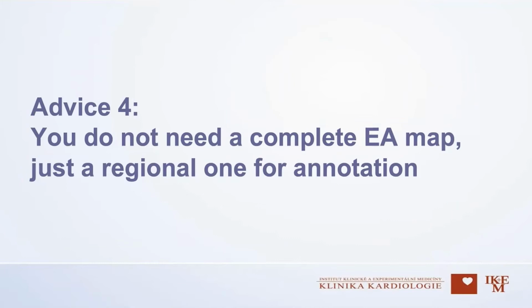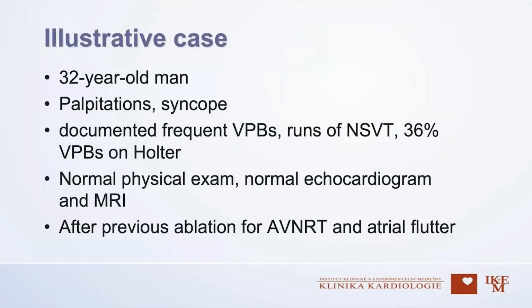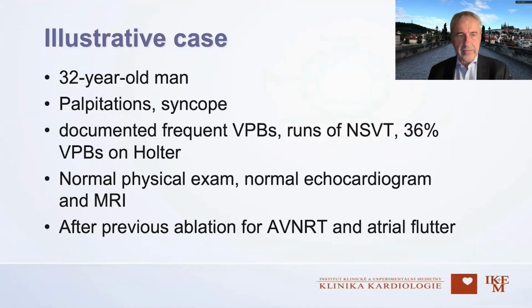And this is another piece of advice: you don't need to complete the whole map of the structure if you really know where you are, and you just need a regional map for annotation of your site of interest. We can also find some foci epicardially. So if you cannot find an endocardial site of interest, you have to go epicardial, which is already a higher level for most operators. This was a young man with palpitations and syncope.